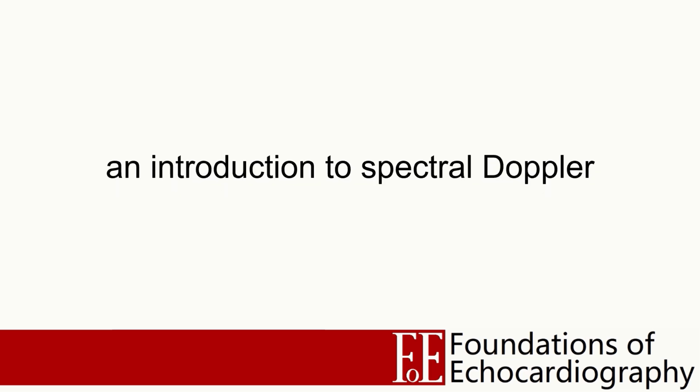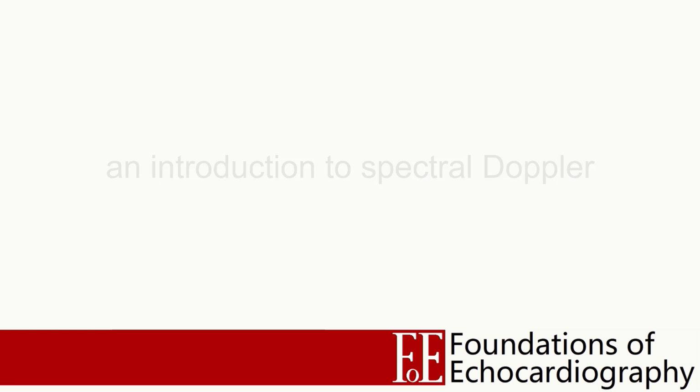Hello and welcome. In this lecture, we're going to take a broad overview of the use of spectral Doppler in echocardiography. The start of this lecture is going to be pretty physics heavy, but if you can make it through those opening sections, we're going to get much more practical, and we're going to discuss how to obtain the most reliable measurements, and then we're going to finish by looking at some of the most common applications such that you can start putting these techniques into practice.